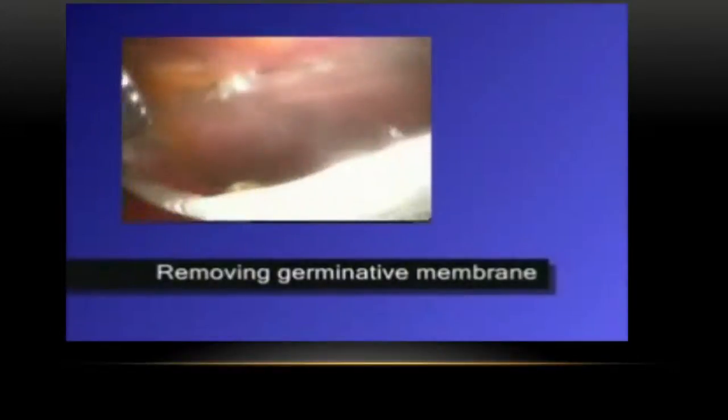Now this is the endo bag, and that endo bag has to be kept. And then the germinal layer you have to transfer inside the endo bag. And then again you have to enter inside, and thorough irrigation, repeated suction. Again, irrigation, repeated suction with the hypertonic saline has to be done in order to kill all the daughter cysts.